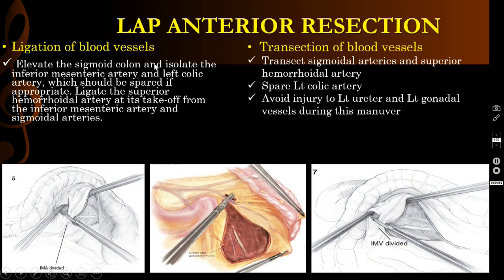So ligation of the blood vessel, here you are seeing, I told you already, you have to ligate the inferior mesenteric artery, that is what you are seeing here. And here you are seeing ligation of the inferior mesenteric vein as well.